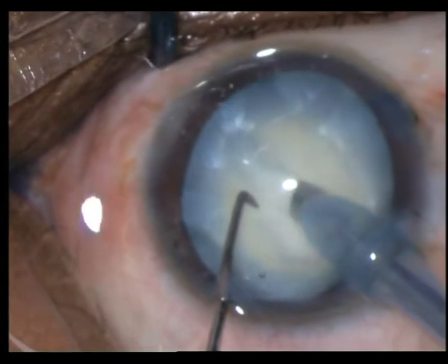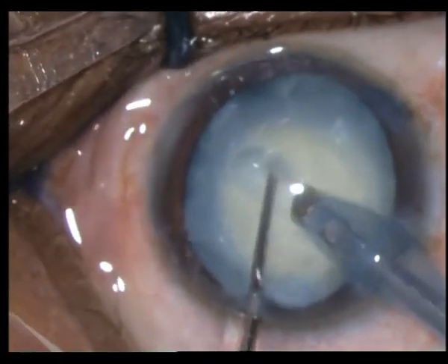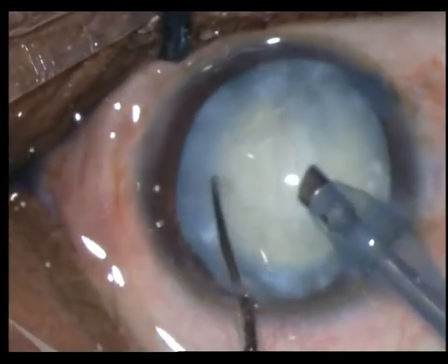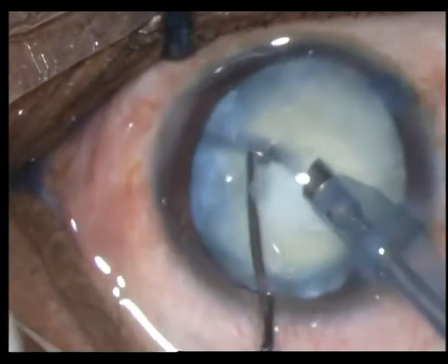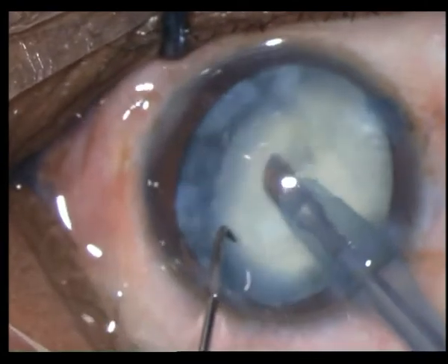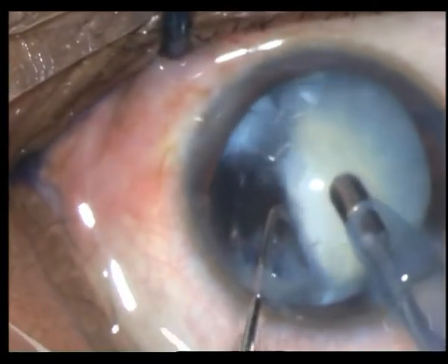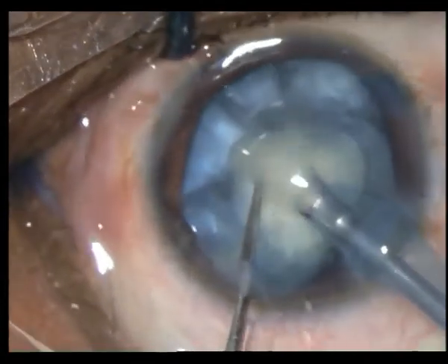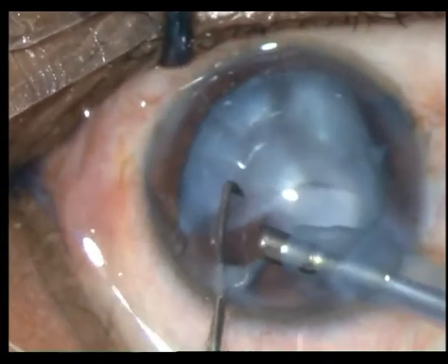I decided not to chop and am making a trench instead — it's very easily separated. I'm trying to take out one of the hemi-nuclei; I know it's going to be difficult. But look how easily it auto-fractures by itself with hardly any effort. Even this one — I'm just trying to hold it and it fractures by itself, and with very minimal phaco power the job is done.